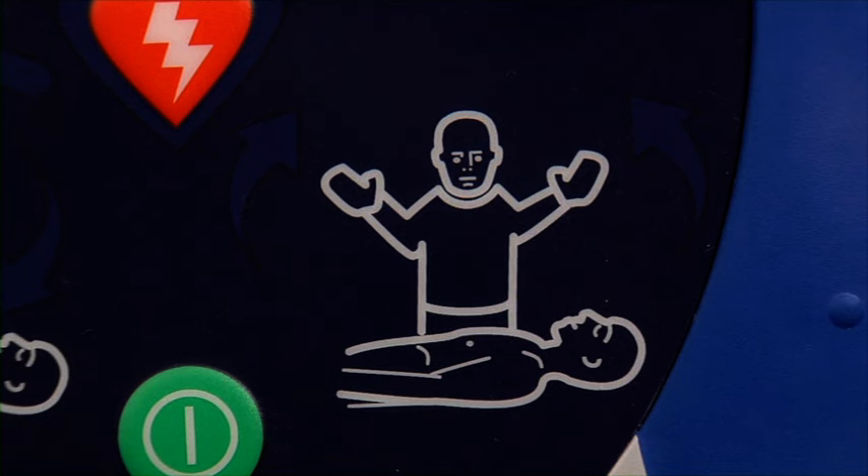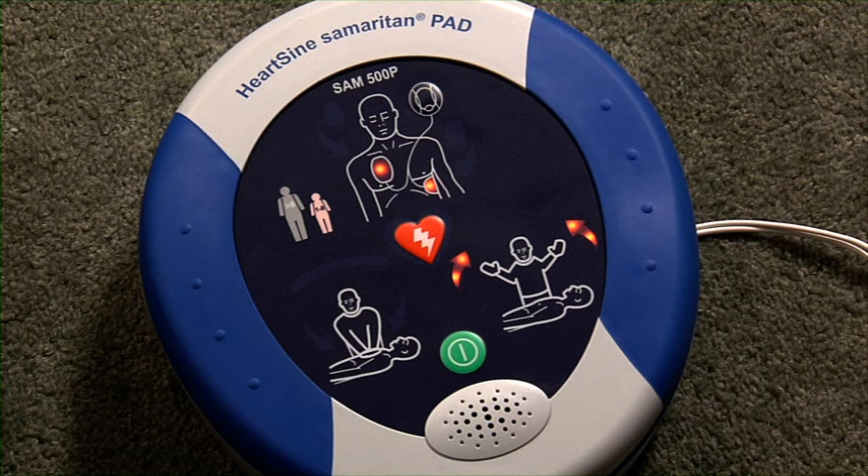Assessing heart rhythm, do not touch the patient. Analyzing, do not touch the patient. Analyzing, no shock advised.